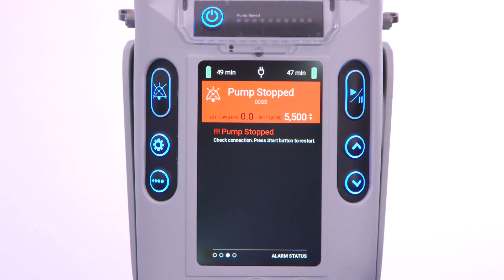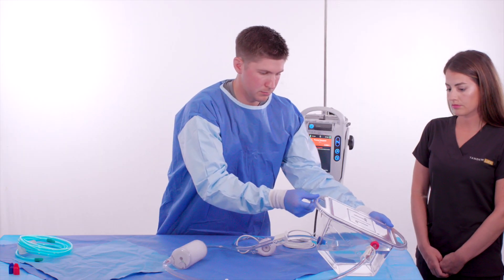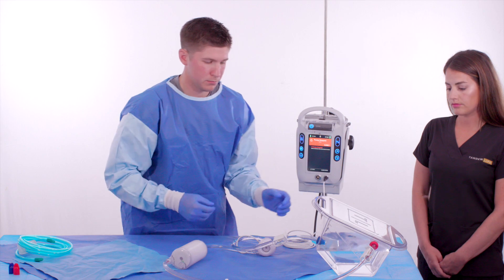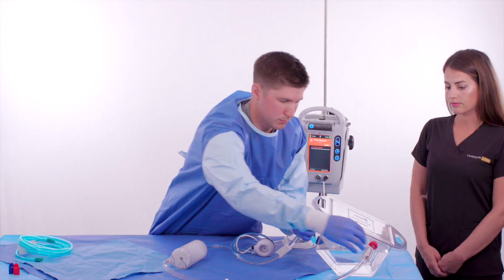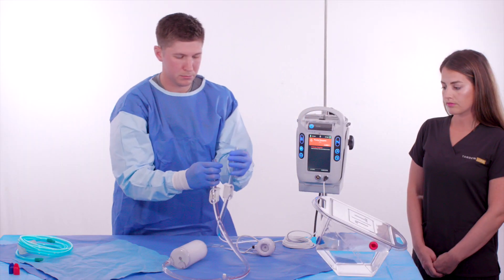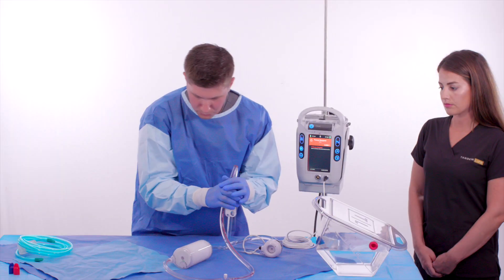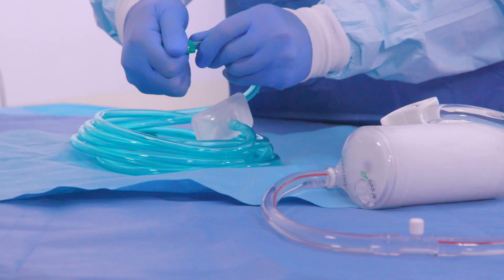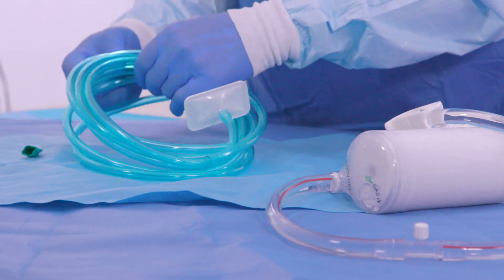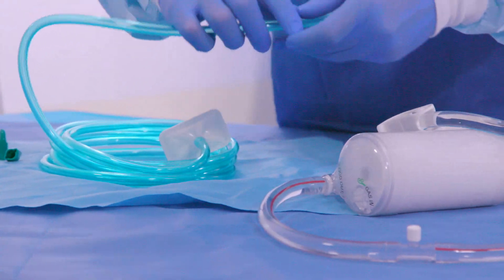Finally, the sterile operator tilts the priming tray back to the fill-ready position and removes the tubing from the basin. A final inspection is performed to ensure all air has been removed from the circuit. Once confirmed, the sterile operator attaches the green oxygen supply line tubing to the gas-in port on the oxygenator.